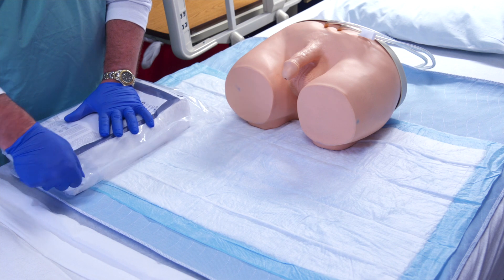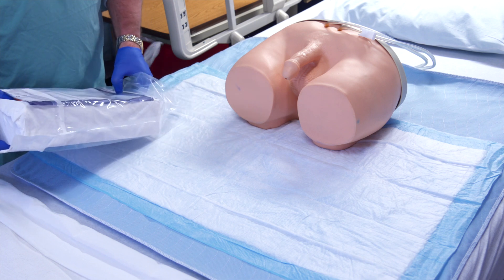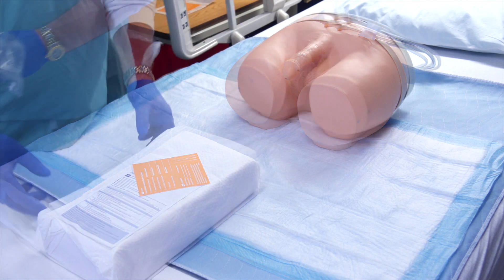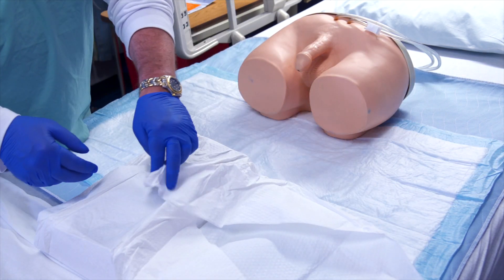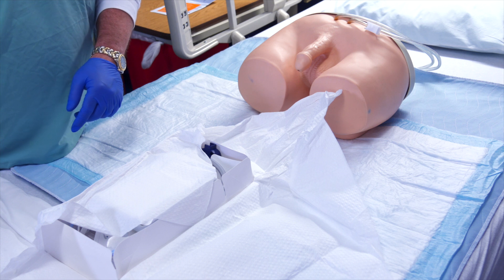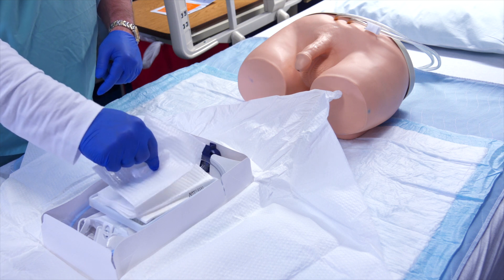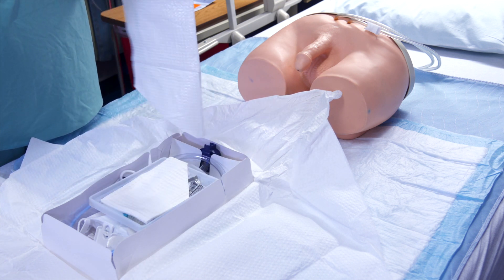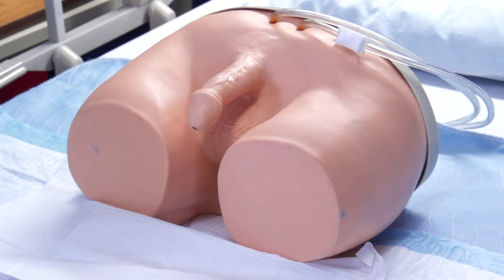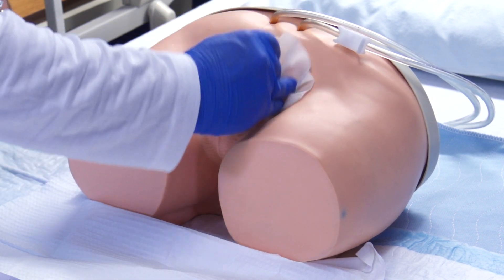Don a new pair of non-sterile exam gloves. Open the plastic wrap and remove the Foley kit. Place the tray between the patient's lower extremities. Open the outer CSR wrap away from you so that you are not leaning over the sterile field. Remove the Castile soap and hand sanitizer and set them aside. Open the inner layer and remove the top drape, holding the back corners, and slide it under the patient's perineal and hip area.